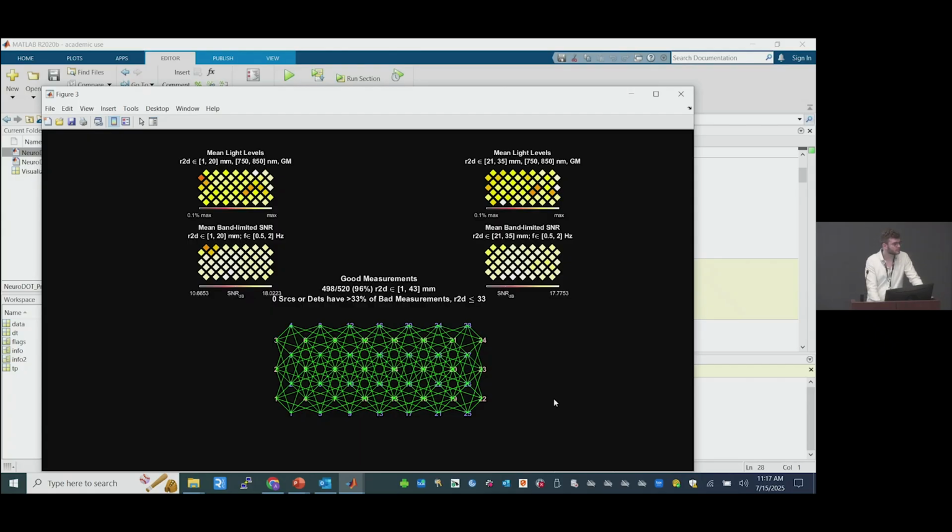Just a question from Zoom when you have a moment. Of course, yeah. Question from Zoom. Can NeuroDOT handle variable duration blocks with added jitter to the interstimulus interval, for example?